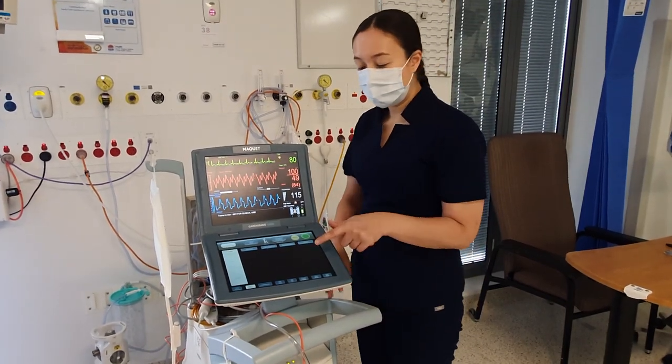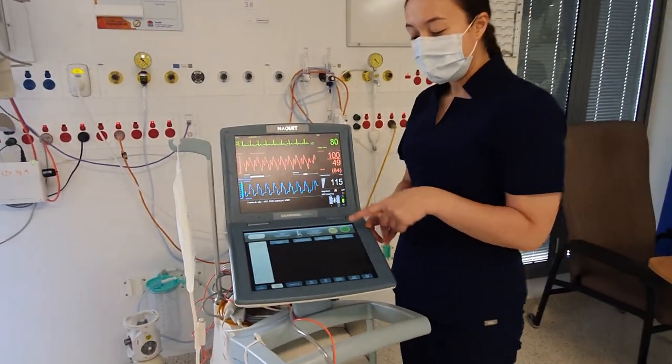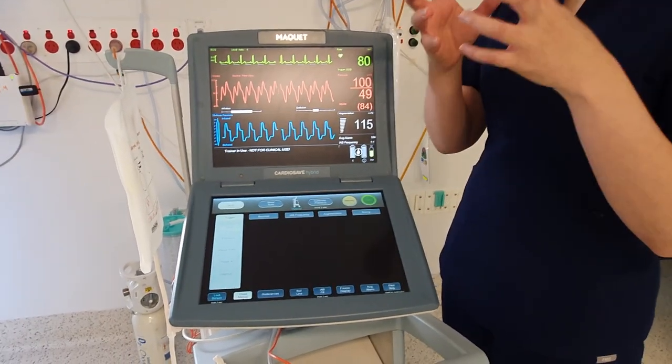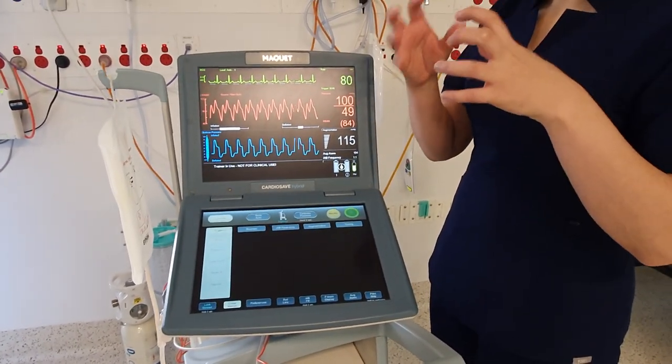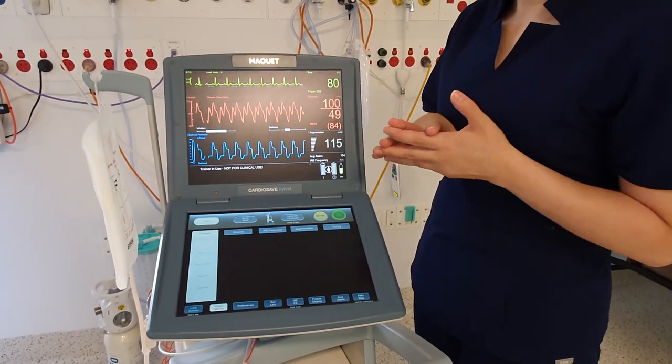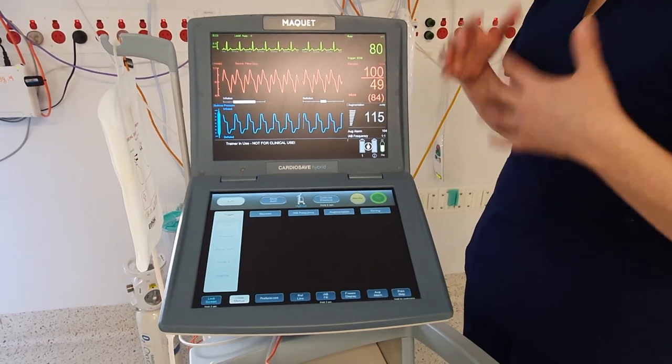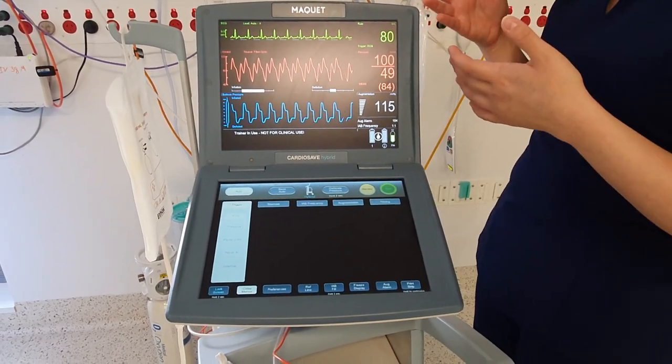Hi guys, I'm going to go through IABP fill on the CardioSafe. What IABP fill does is it fills the balloon of the intra-aortic balloon pump with helium. The helium generally lasts for about two hours. The only reason it'll run out faster is if the patient is tachycardic.